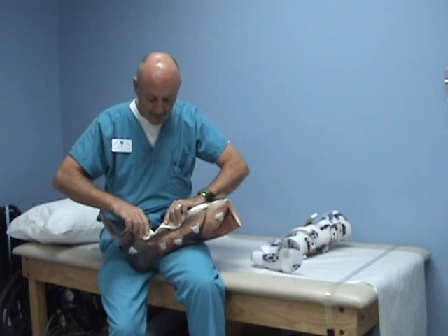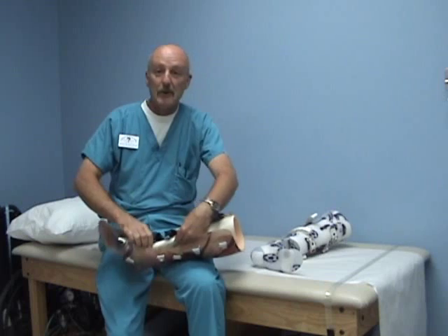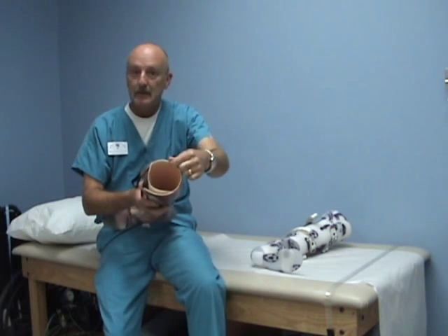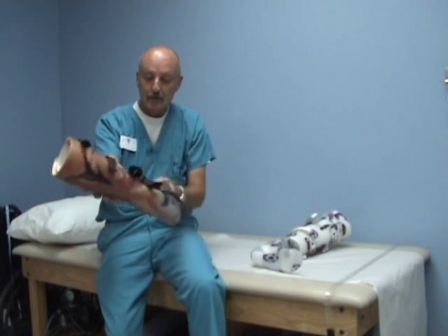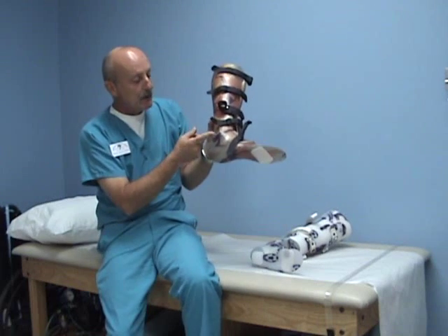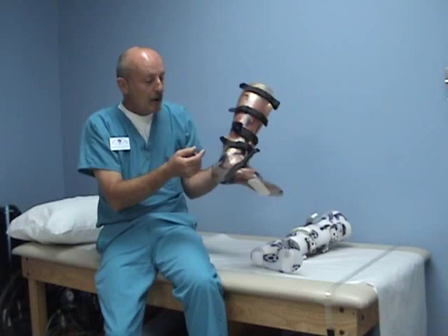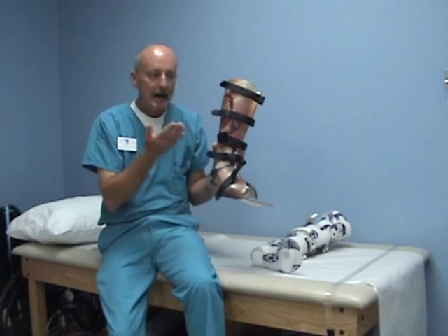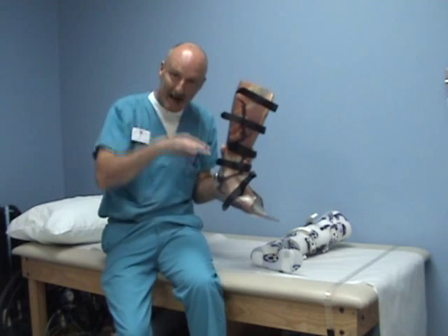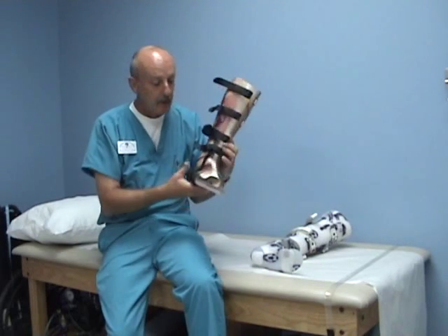We take one-eighth inch polypropylene and stretch it significantly to end up with about a one-sixteenth inch thin piece of plastic that fits in the shoe. You need to get a good intimate fit except in certain areas. You need to build up your malleoli, and you need to elongate your build-ups because they are going to move up and down. When you take weight off of this foot, the heel is going to come up. When you step down, it's going to drop down.